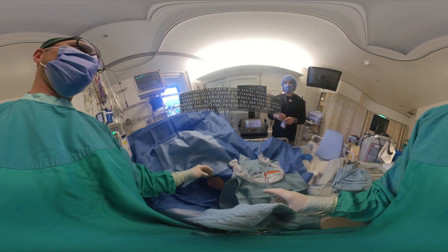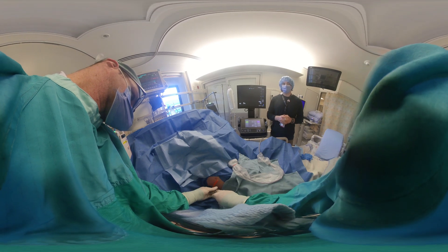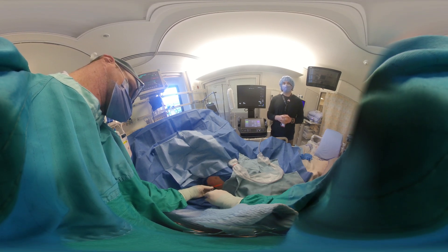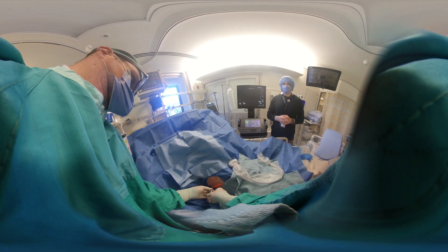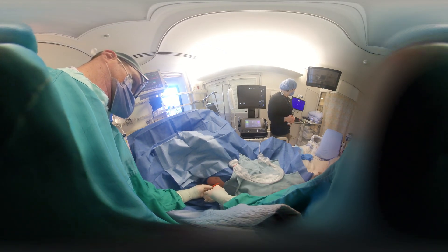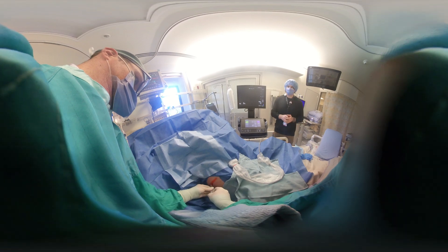Now we're going to freeze the area. We'll freeze the skin first, then move into the periosteum, and once that has adequate time to settle, we'll introduce a large needle — usually around 22 gauge, one and a half inch — all the way down over the rib into the pleural space to make sure we have a satisfactory tract infiltrated with local anesthetic. We've now got a clear tract all the way down to the pleural space.